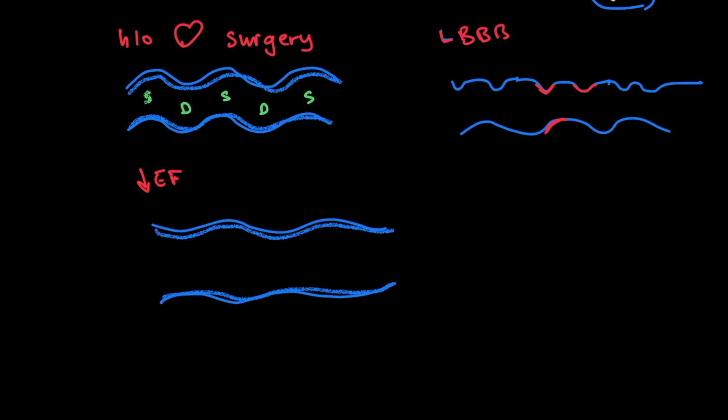But what you can actually look at is the mitral valve. Remember, the mitral valve is open during diastole, closed in systole, open in diastole, closed in systole, open in diastole, and you measure this distance. The separation between your early wave, the E, and your septum, E point septal separation. If that is large, as I've drawn here, if that early wave doesn't come close to the septum, that's a sign of a reduced ejection fraction.